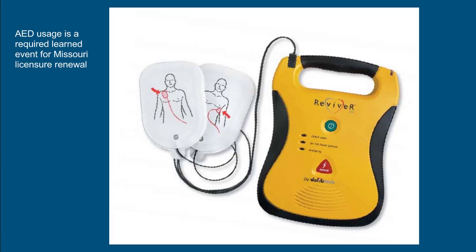Most likely the lay public will expect us to manage sudden cardiac arrest if it were to occur in our office, not necessarily where we're in our treatment area, but perhaps in the waiting area. Certainly the research supports the evidence that immediate defibrillation is important for sudden out-of-hospital cardiac arrest.